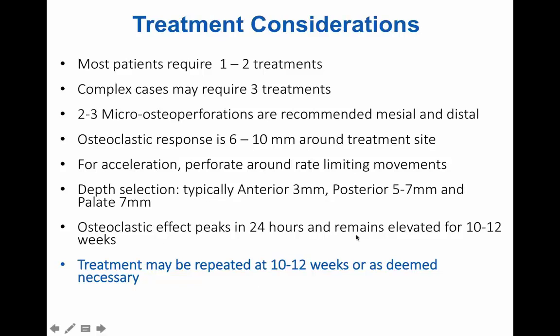So I'd say somewhere between 2.5 to 3.5, maybe even as long as 4 months, you'll see the effects of micro-osteoperforation. In cases where I've delivered this twice, I've repeated it somewhere between the 3 and 4 month mark to help the patient's case move faster. Use 2 to 3 perforations per root, mesial and distal, as long as you have enough bone between those roots, and you can easily evaluate that using a Panorex. You don't necessarily need 3D technology. I don't use 3D technology at this point, and certainly not to evaluate a case for micro-osteoperforation.